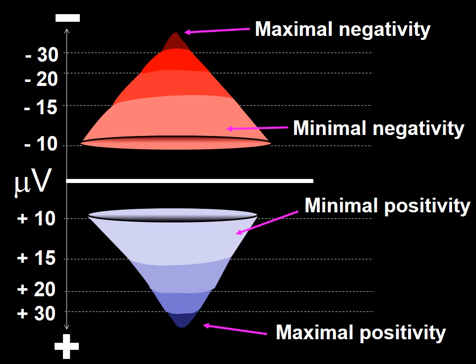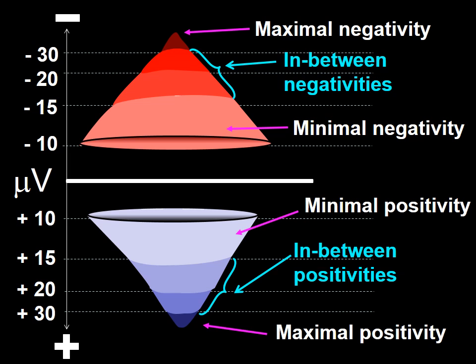And in addition to maxima and minima, electrical fields have in-between or intermediate levels. Here I am representing in-between negativity for the negative field, and in this frame I am representing the same thing for the positive fields.